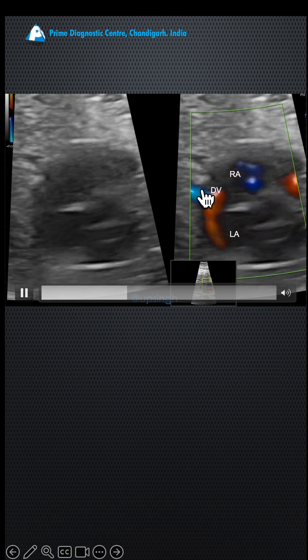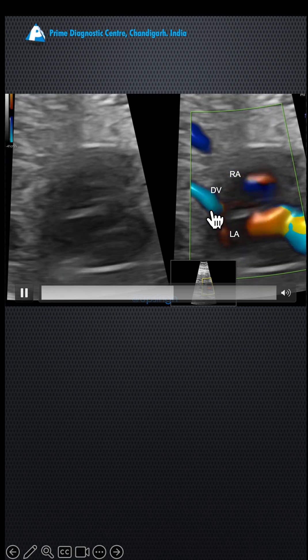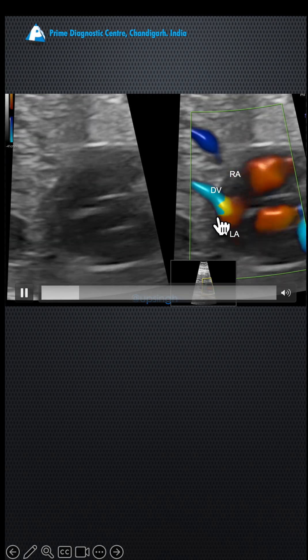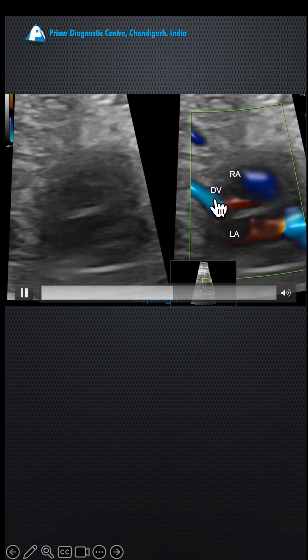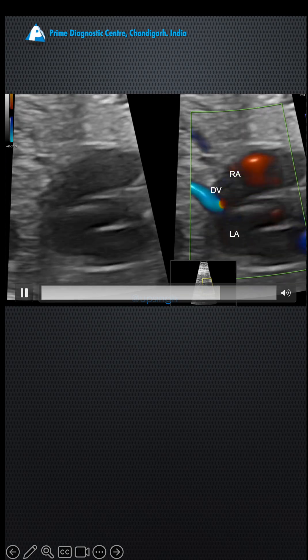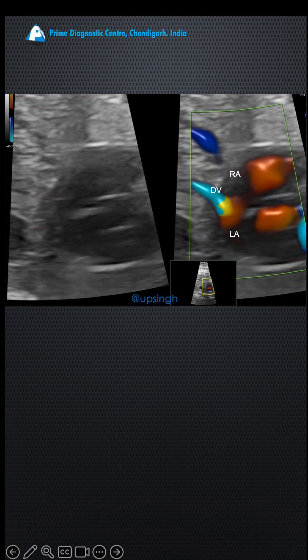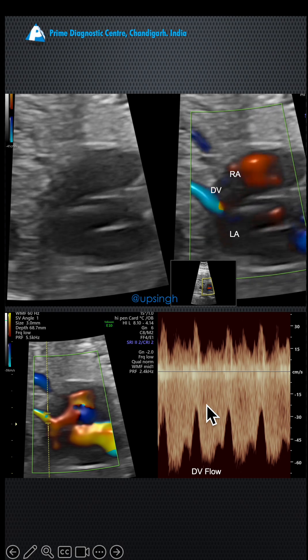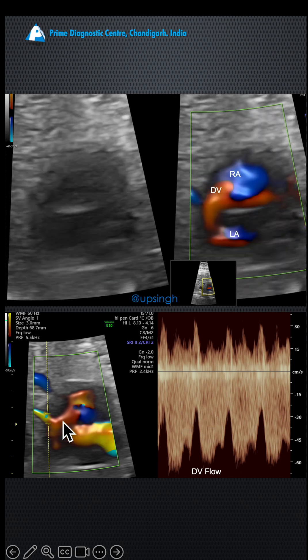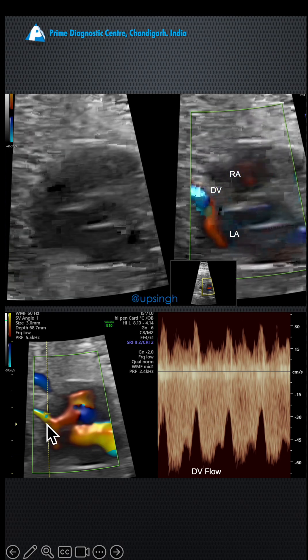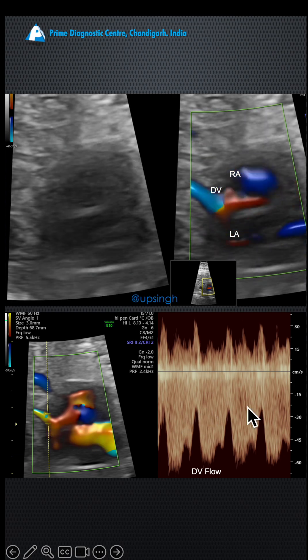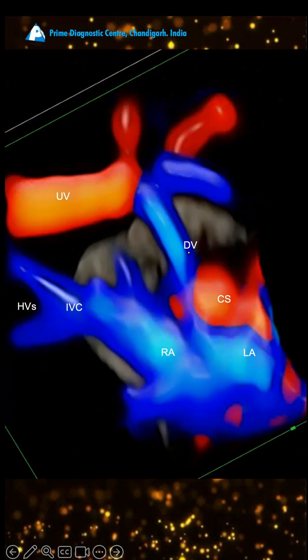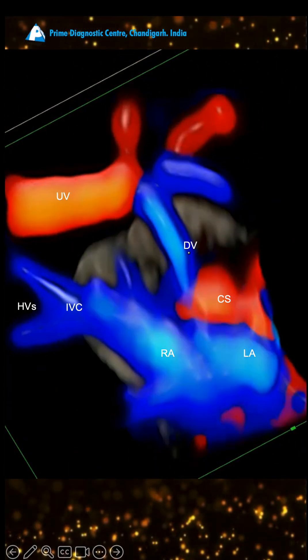Here you can see the DV entering into the coronary sinus at its mouth — the opening of the coronary sinus into the right atrium. When you place the pulse Doppler there, you see the DV flow right in that area where it is entering into the coronary sinus.